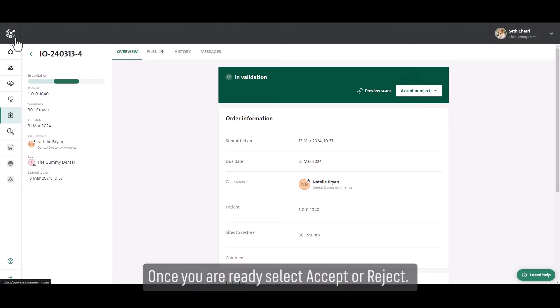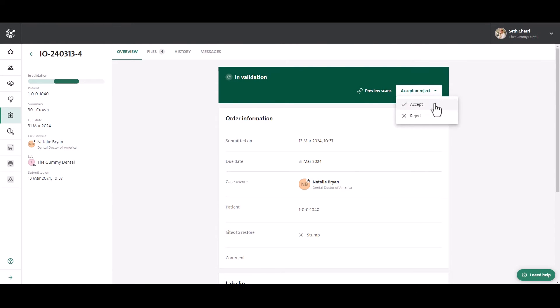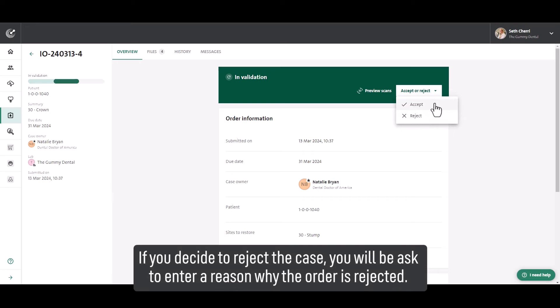Once you are ready, select accept or reject. If you decide to reject the case, you will be asked to enter a reason why the order is rejected.